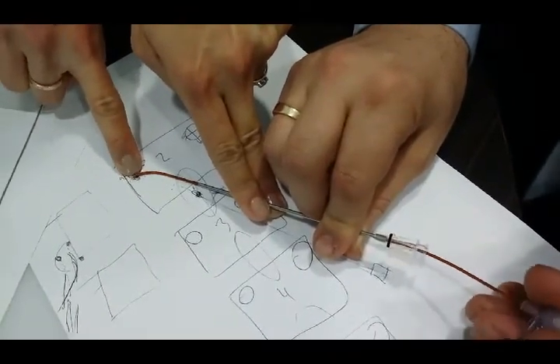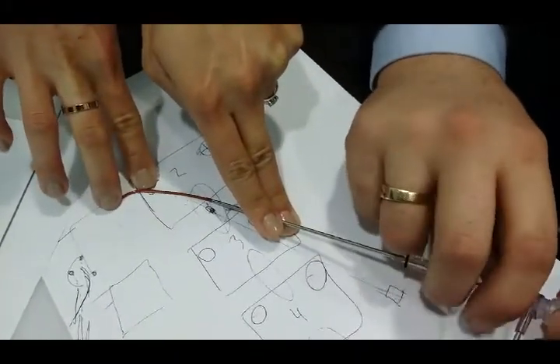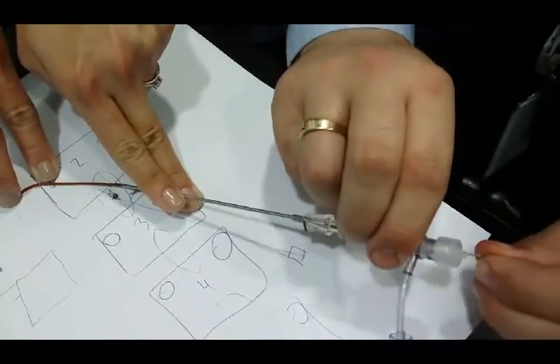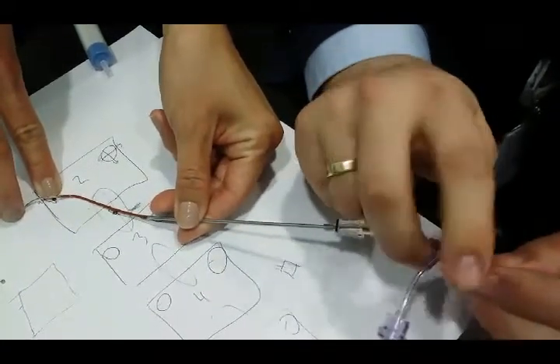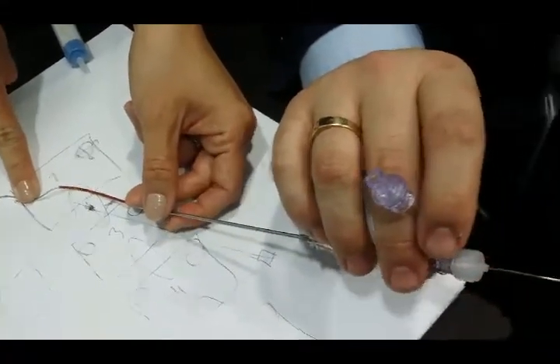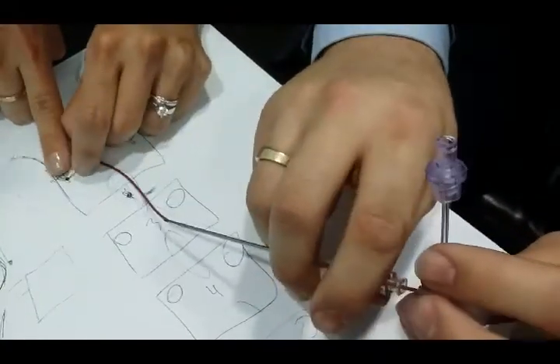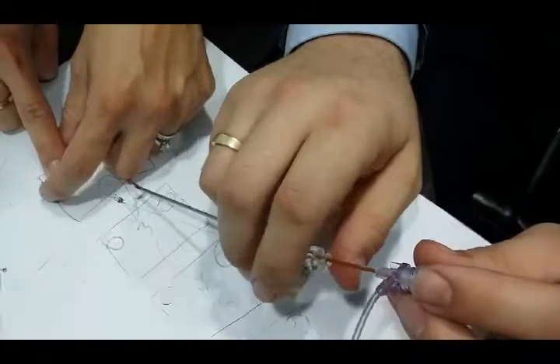I'm going to try and drive it up towards the pedicle at six o'clock - hit right up against the bone, bump it out, pop and pop. Take it out - four electrodes. Unlocking the hub enables us to reverse the sheath. Knocking the hub, reversing the sheath, and just put a slight rotation towards the cranial position so the lead sits up against the pedicle. Advancing the sheath - you've got to let go and the electrodes will draw back to their final position. Boom, perfect.